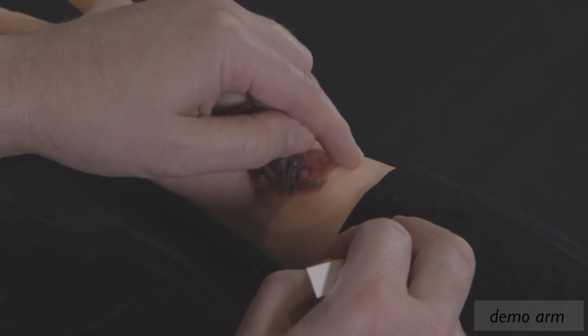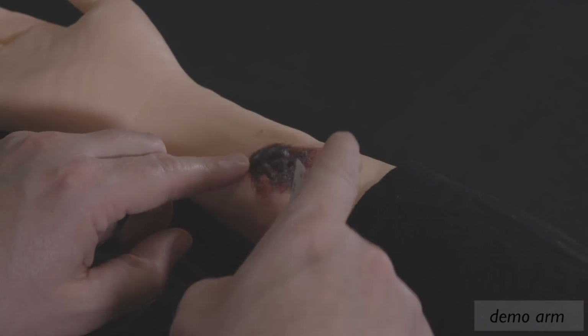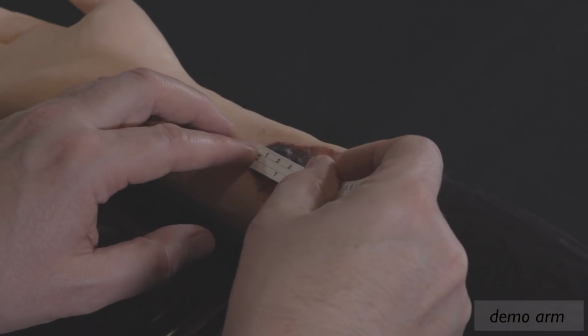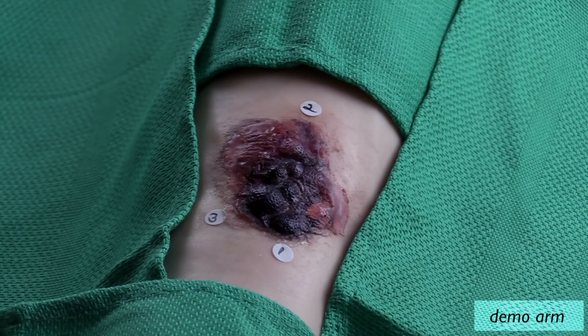As the PI measures the tumor, the clinical research coordinator or nurse records measurements on the tumor assessment log. All accessible target lesions, as well as any other lesions that will be treated using electroporation, should be photographed and measured. Each lesion should also be numbered and labeled.